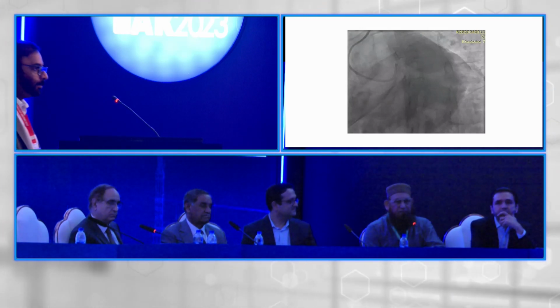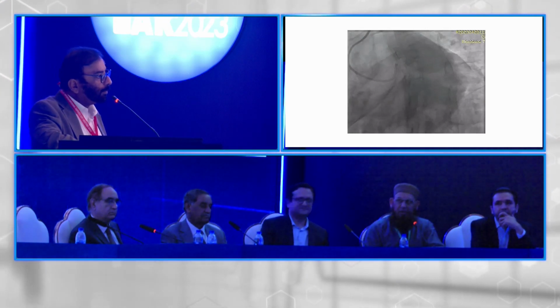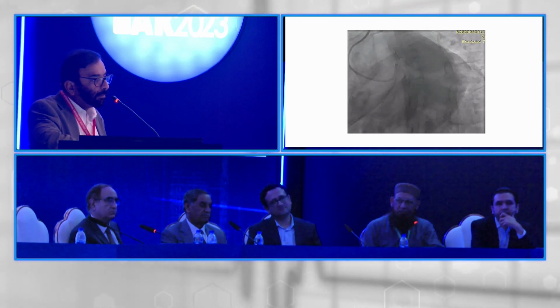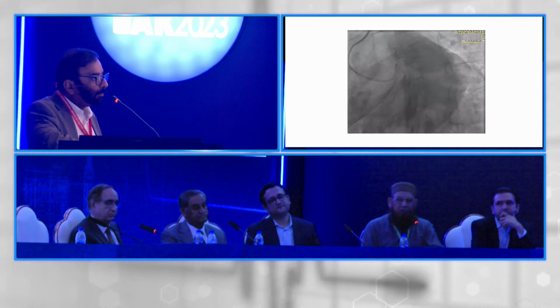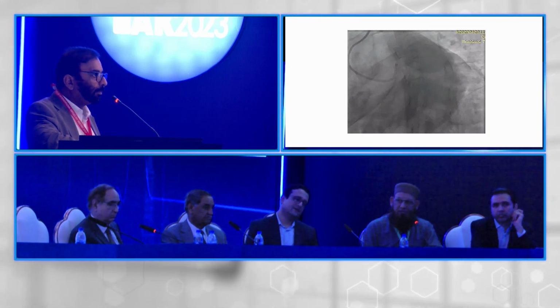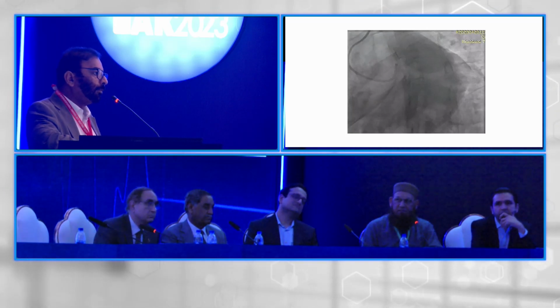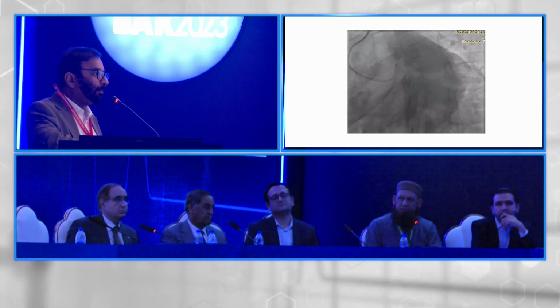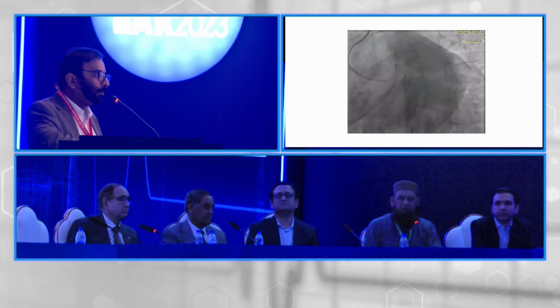First, I would like to differentiate from SCAD, because all the coronaries look normal in a young patient, so it could be a localized dissection. IVUS will help to tell whether it's a diseased segment or a dissection. If it's atherosclerotic disease, because the left main is a very large vessel, technically it's not that difficult. We need to save the left main and stent it because it's a very large left main, projecting a few struts across the ostium of the ramus and then stenting. But first we should differentiate whether it's disease or dissection.